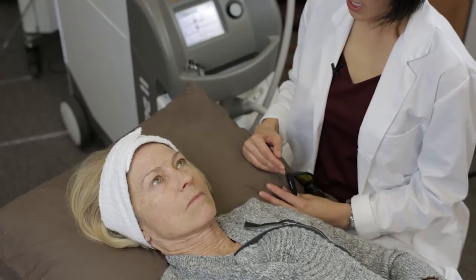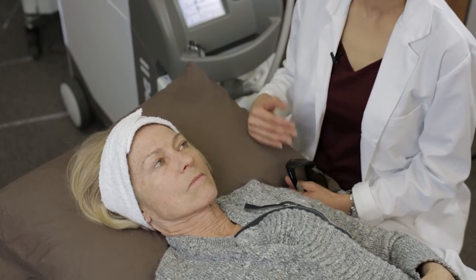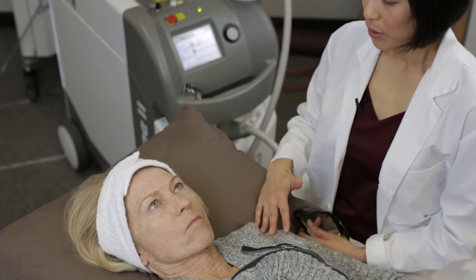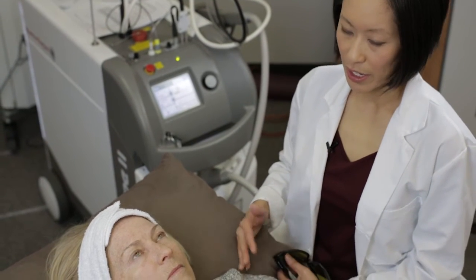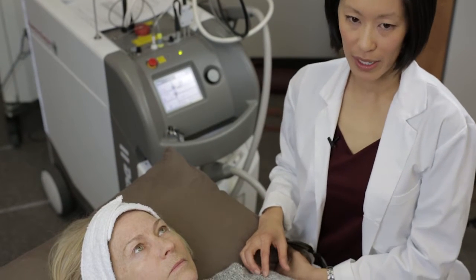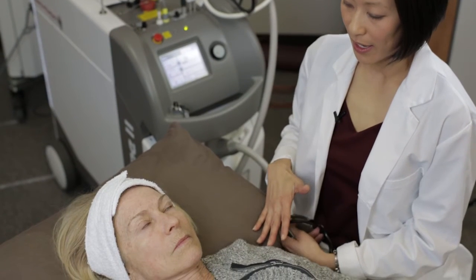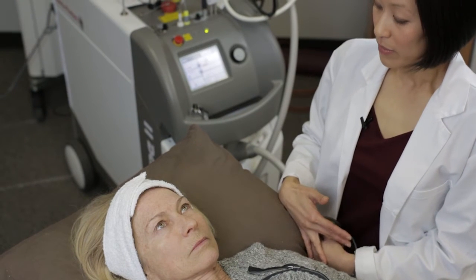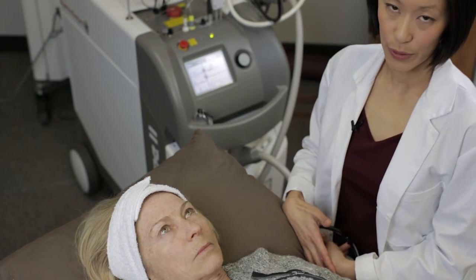For pigment, I typically recommend using a pretty low pulse width because pigment is very superficial. And because Darian here is roughly a Fitzpatrick type 2 skin type, I'm going to use an energy level or fluence that is towards the higher end of the recommended settings. Fair-skinned people can actually tolerate the laser more than skin of color, so I can use a bit of a higher fluence setting.